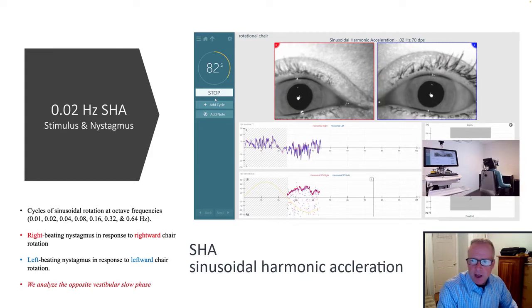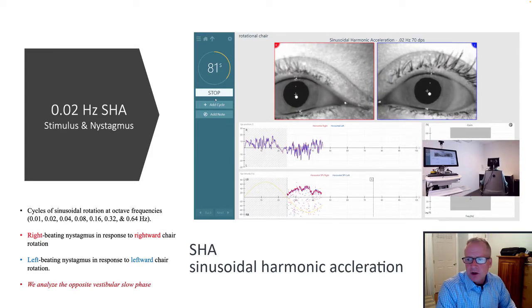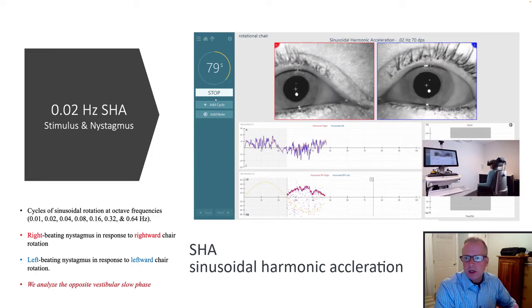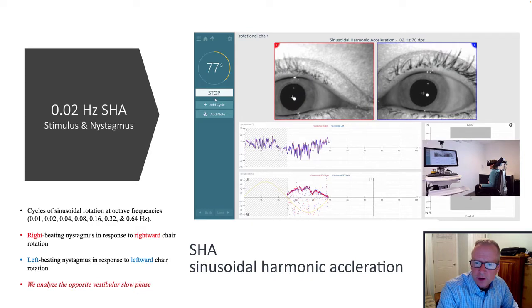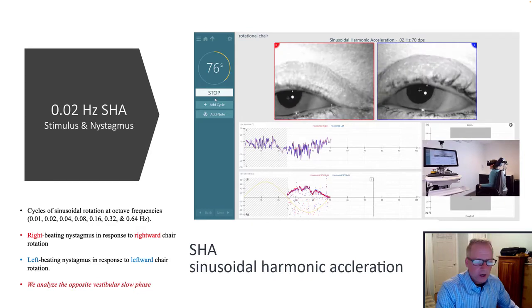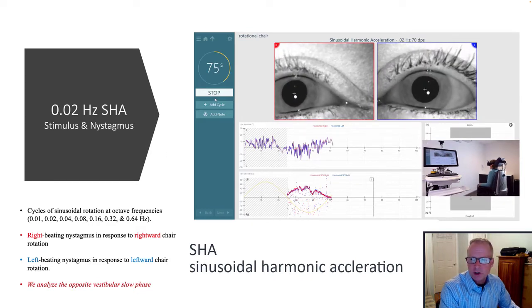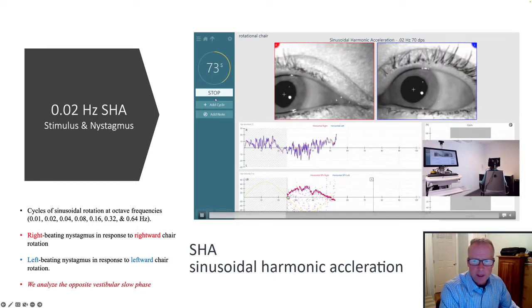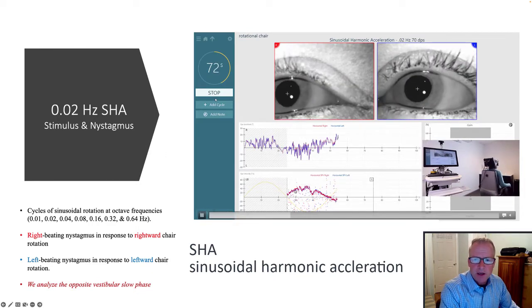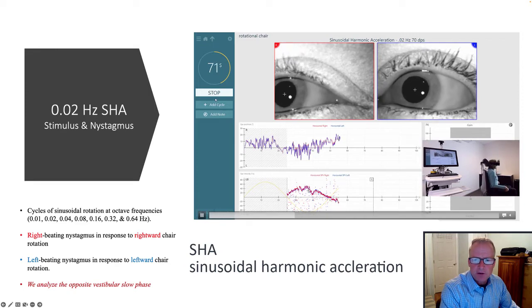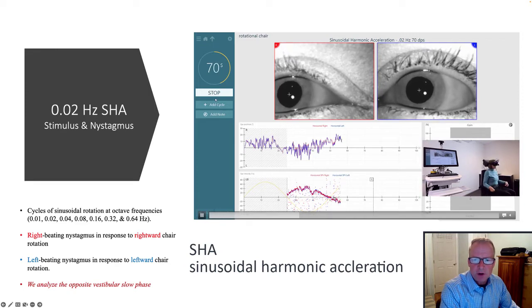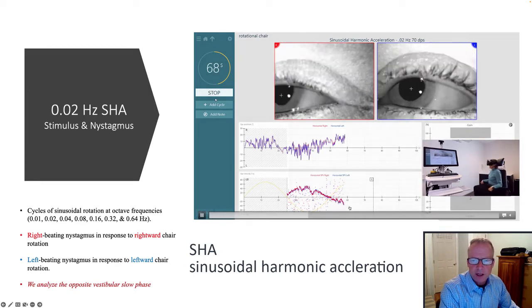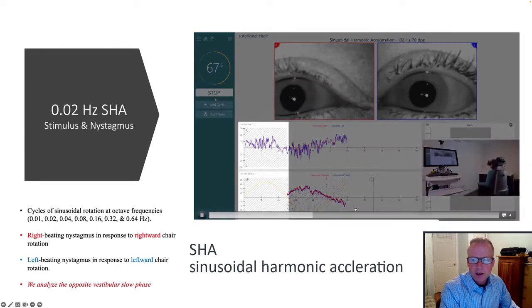As you see here, during leftward rotation, you generate a left VOR, and then during rightward rotation, you'll generate a right VOR. That is plotted here in the slow phase component that we're most interested in during SHA testing.